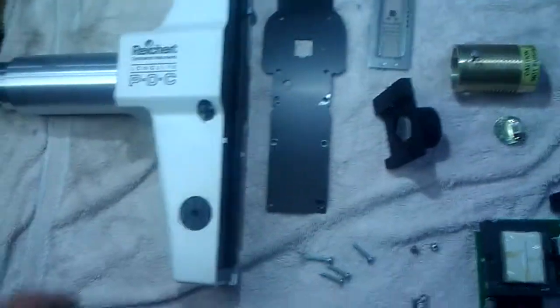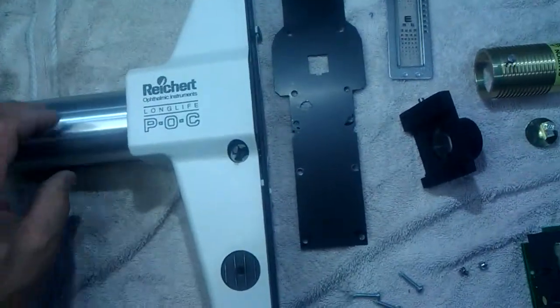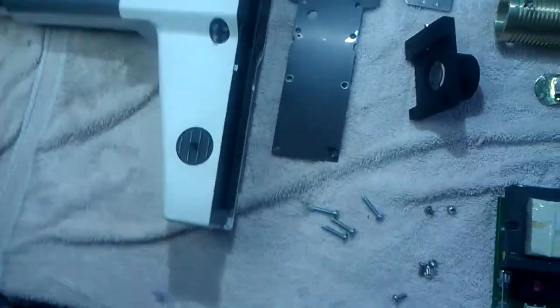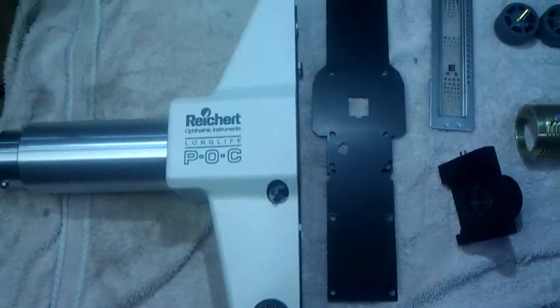We've got this Rikert projector here. It's a model 12084. It's a manual projector, but it's a good projector.